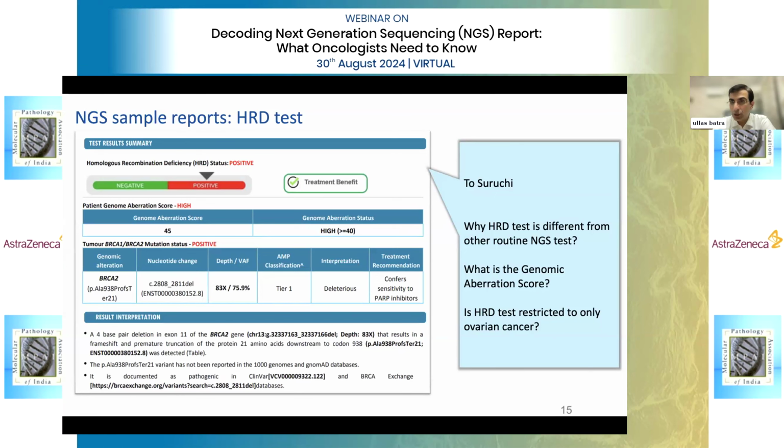That is technical, that is very important. Yes, Dr. Vindhya, you have a point. There is one more Indian lab for which we have been sending NGS, and on the NGS they were reporting HRD. Is it possible? Ma'am, HRD can only be determined by two methods. One is based on genomic signatures, LOH, TAI, and LST scores when they are calculated, or SNP-based profiling using copy number profiles. So we need to check what basically they are doing.